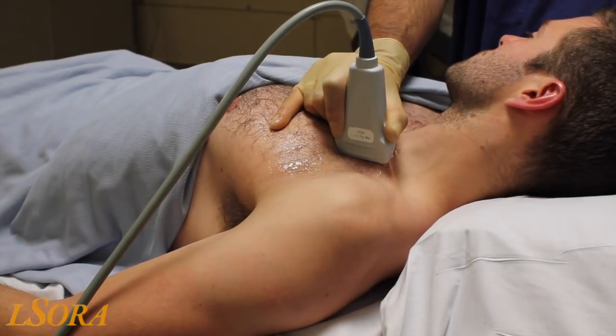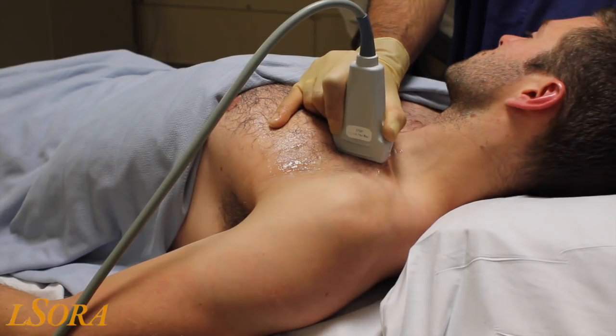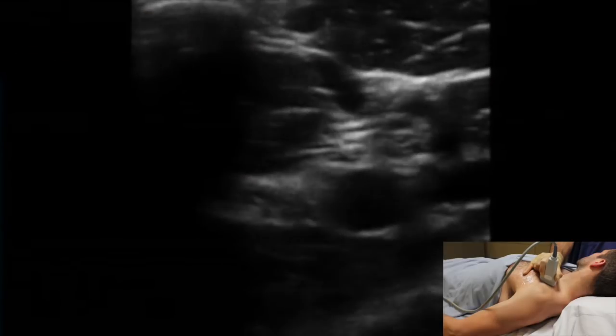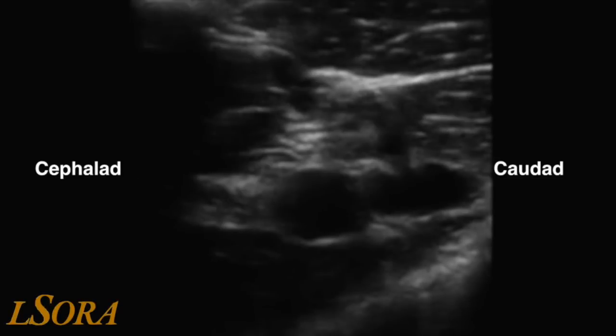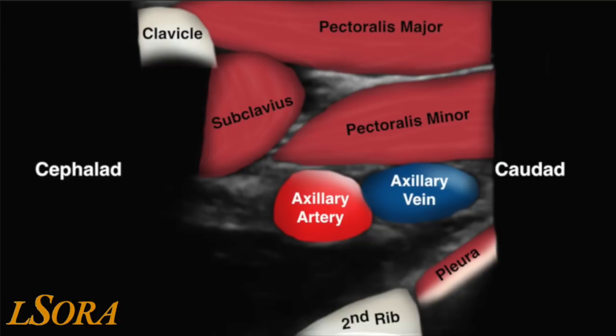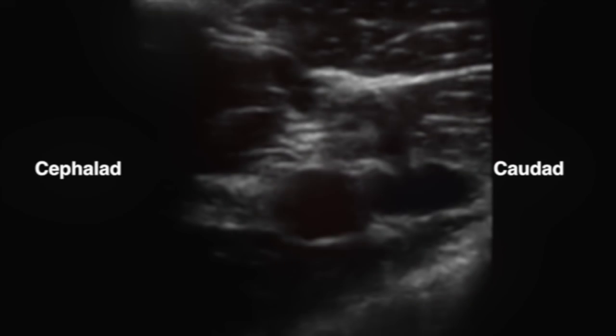To start scanning for the PEX block, place the probe in a paramedian orientation just making contact with the clavicle, similar to the position for an infraclavicular block. The image generated will look like this, with the clavicle demonstrated cephalad, the pectoralis major muscle superficially, deep to that pec minor, and you may also identify subclavius. Deep to the muscular structures, you will identify the axillary artery and the axillary vein. If a rib is visualised, it is likely to be the second rib, and you can see the pleura lying adjacent to it.